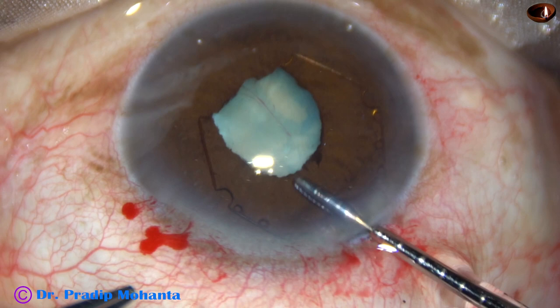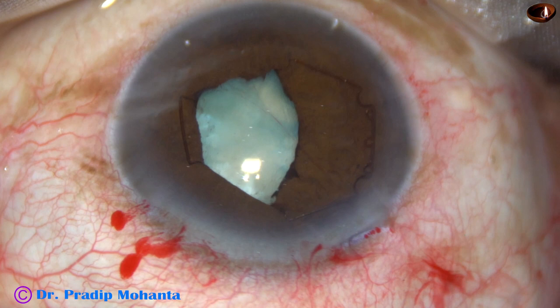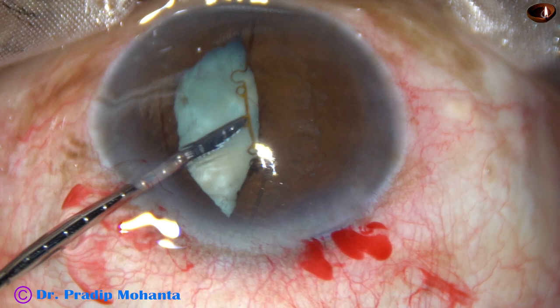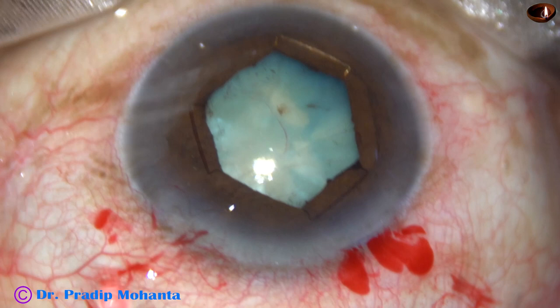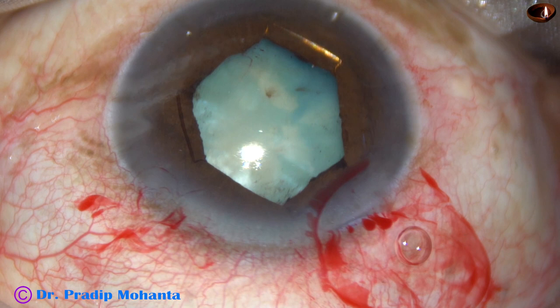Alternate flanges are tucked to dilate the pupil. Now going through the left side port, the flange at 10 o'clock is tucked under the iris. The pupil has taken a hexagonal shape. You can see that the capsule has stained all around because I injected dye in the posterior chamber.